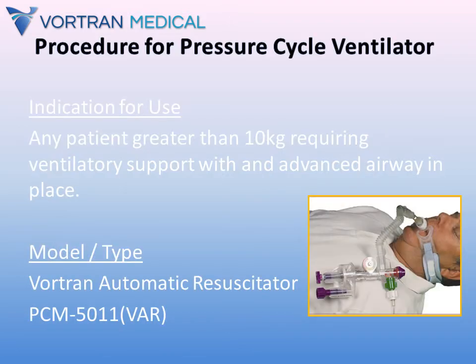Automatic ventilators offer several advantages over a bag valve mask, as you will see. However, in order to appreciate the importance of proper ventilation as opposed to simple oxygenation as we do with a bag valve mask, we will need to have a greater understanding of respiratory physiology and realize that there is a much bigger picture here than just pushing air into someone.